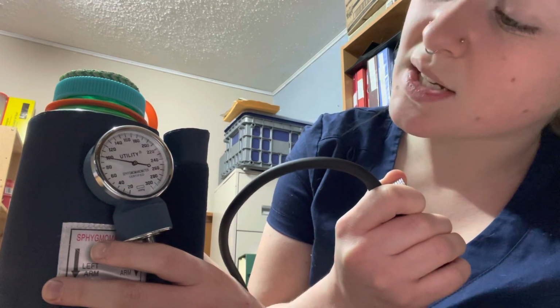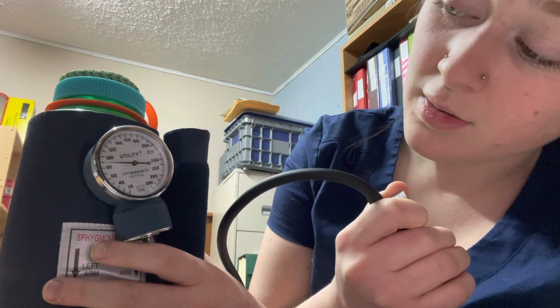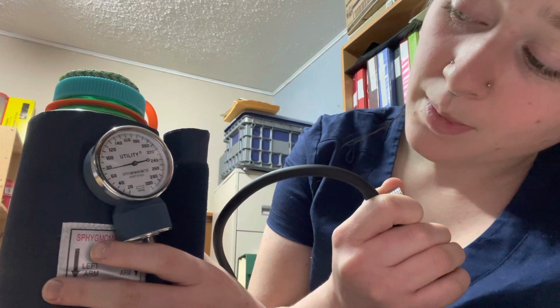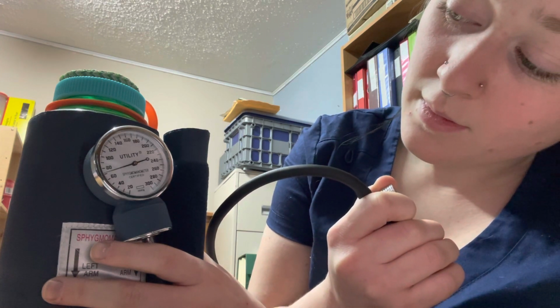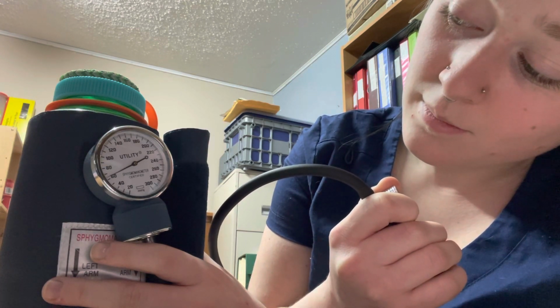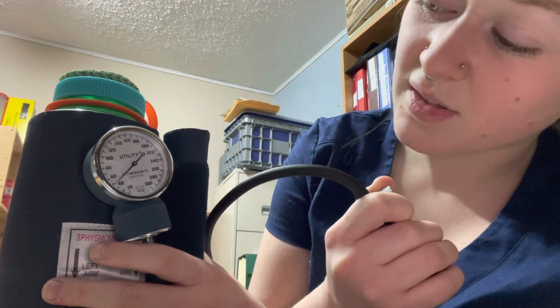And I would keep listening until I can no longer hear a sound. This time I'm going to be dropping until 50 millimeters mercury. And I did have a bit of a sudden drop there, but all right. And that is how you take a blood pressure. The values that I get for the first sound and the last sound that I hear correspond to the systolic and diastolic of the average blood pressure being 120/80.